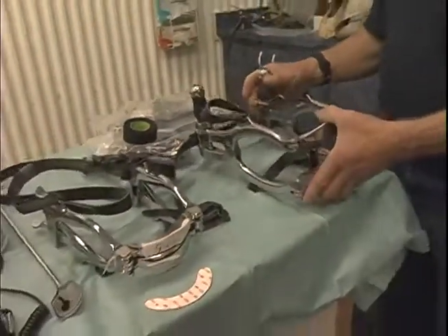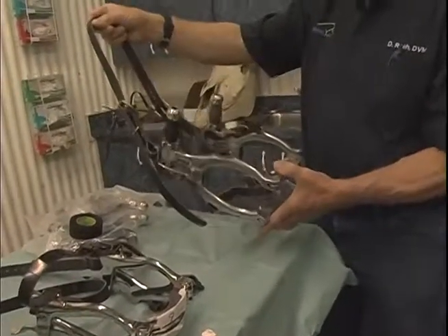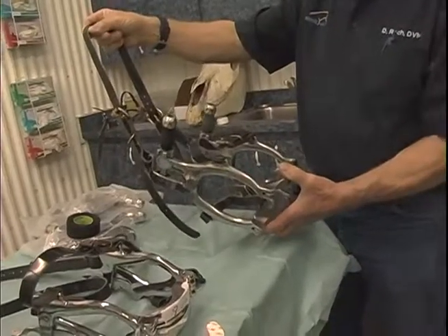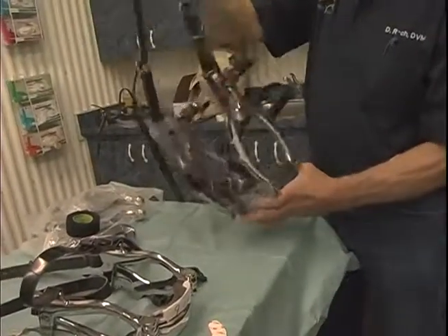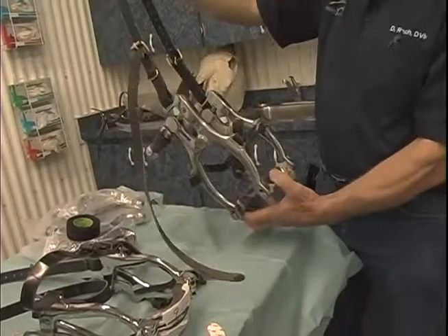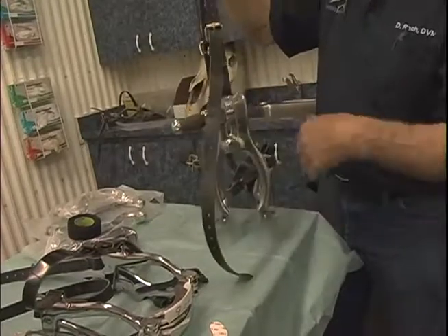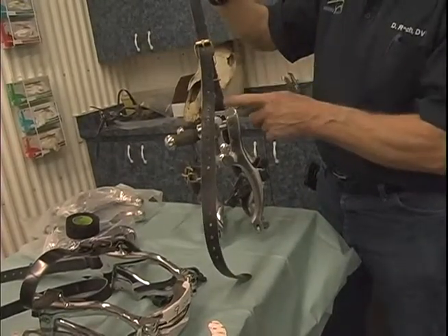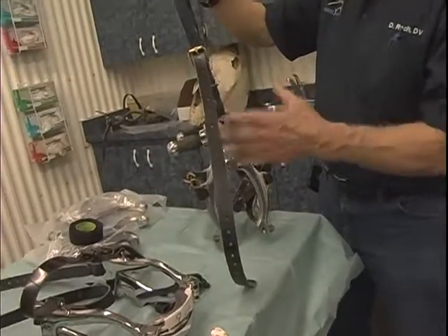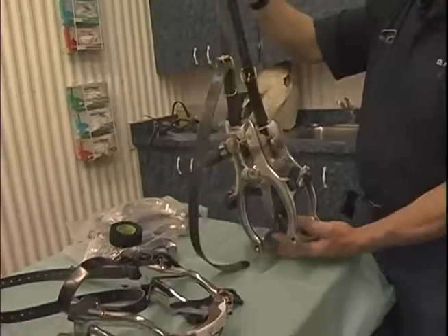This speculum can be put on the horse's head with the arms in the up position, which is the way that I do it primarily, but it can also be installed on the horse's head with the turning handles down. There are buckles on both sides of the pole so that it doesn't matter whether you have this in the up position or the down position on the horse's head.